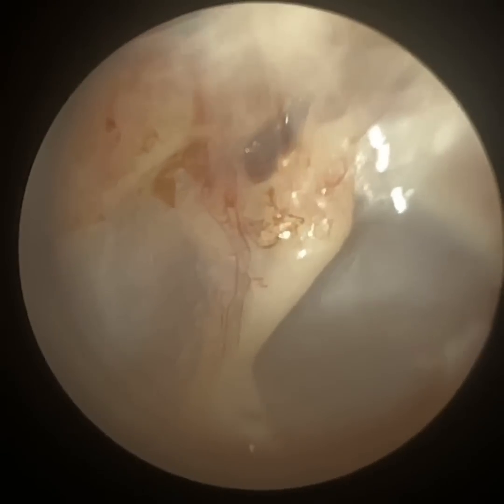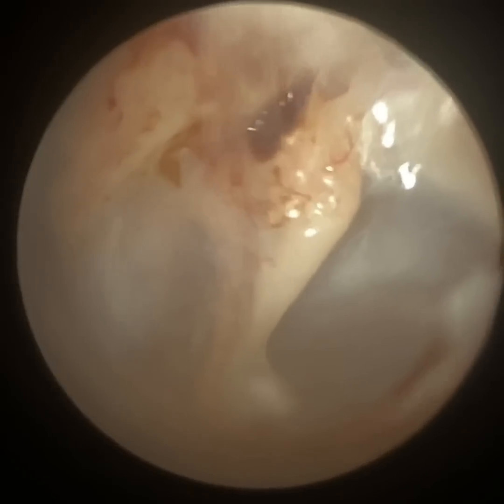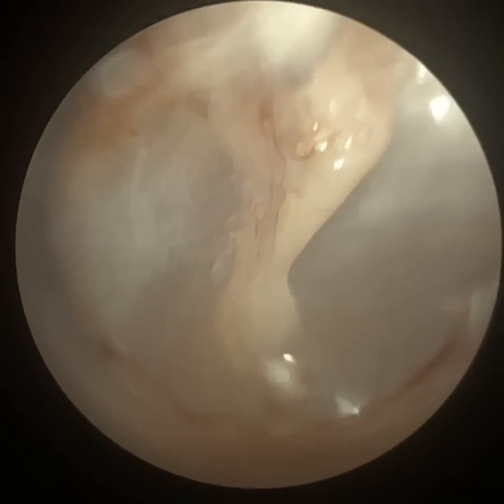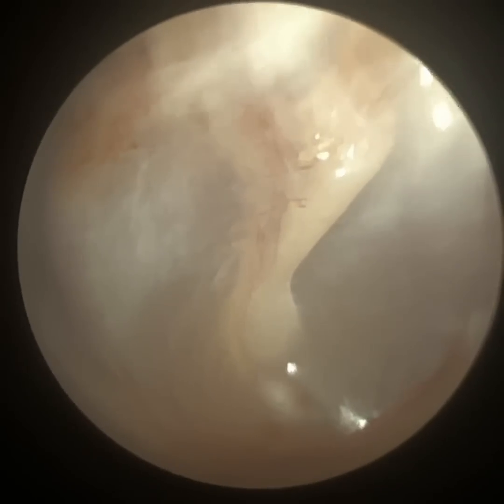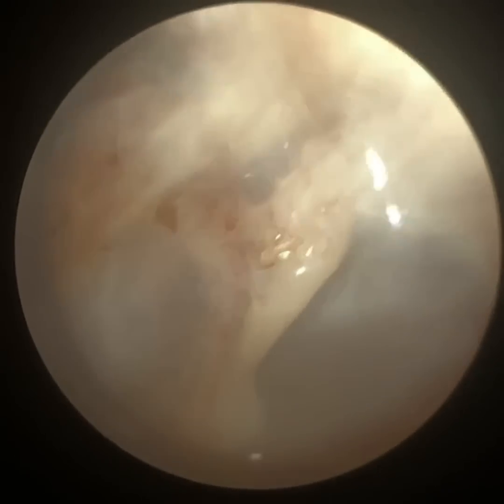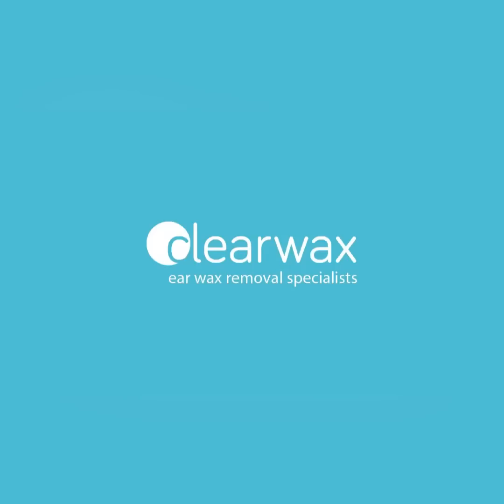I'm going to leave it there. I'm going to look back at the eardrum. I'm going to look superiorly, right, kind of a mild attic retraction there. And I'm just trying to look down towards the bottom of the eardrum, but because of that inferior recess it can be a bit difficult, but you can see the light reflex there. And this is all the dead skin I removed from the patient's ear, and you can see those sheets of dead skin as well as the plugs, some of them quite dark, especially the ones that are deeper in the ear because it's oxidized.